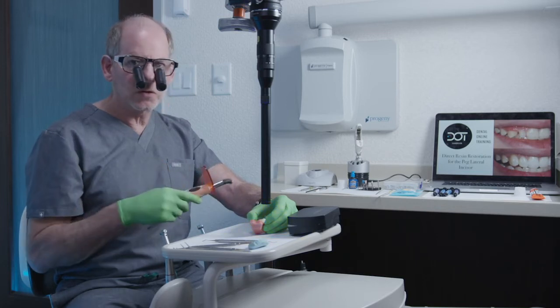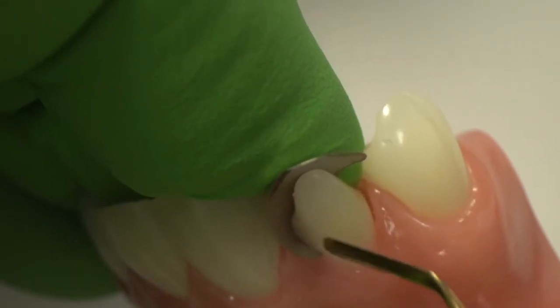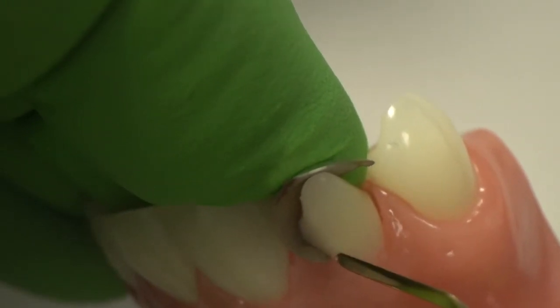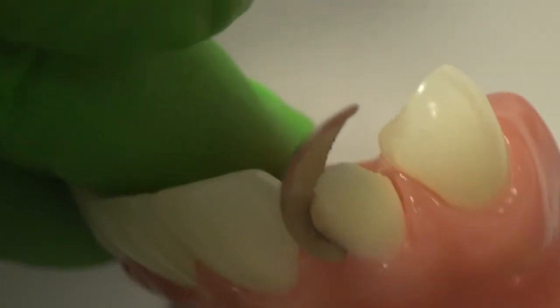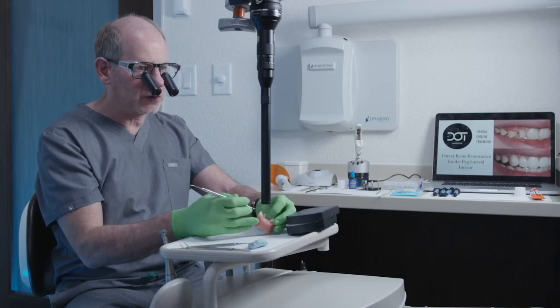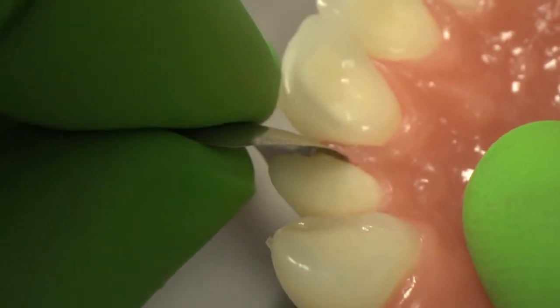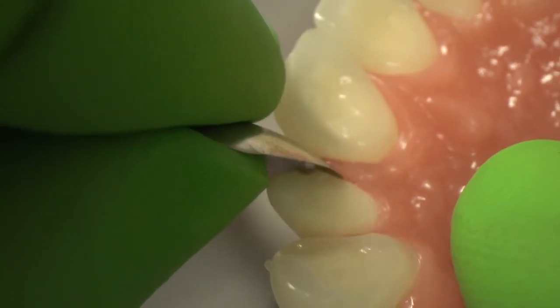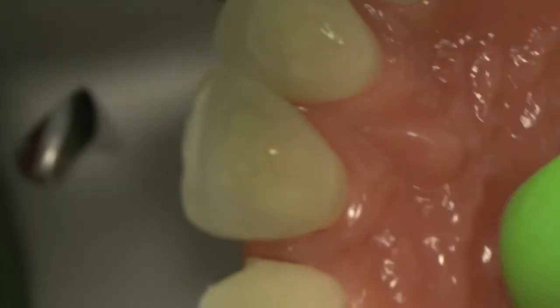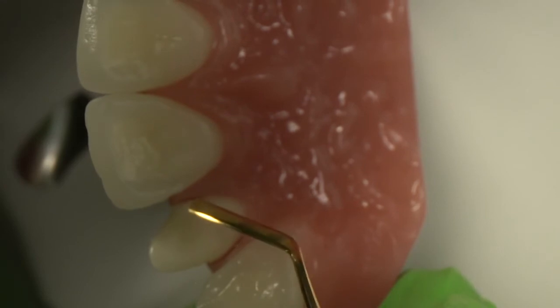I'm going to cure this for about three to five seconds. That's going to harden the material towards the front of the matrix band. Now I can relax my finger and come back to evaluate the palatal and make sure that it's nice and smooth. We can do that with the matrix band on or we can remove the matrix band in the mouth. In this case, we'll remove the matrix band so that we can inspect. The composite will still be somewhat soft on the lingual, so we'll be very careful as we're lifting that off. Then we can use the IPC instrument to come in and blend the composite to make sure we have a smooth transition.